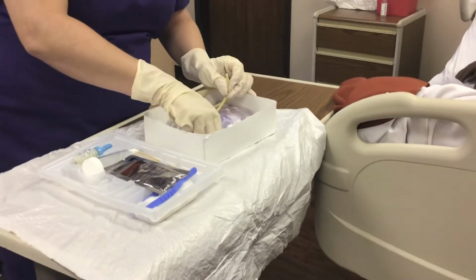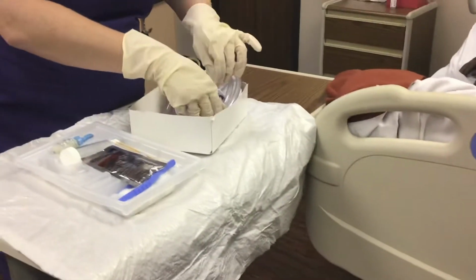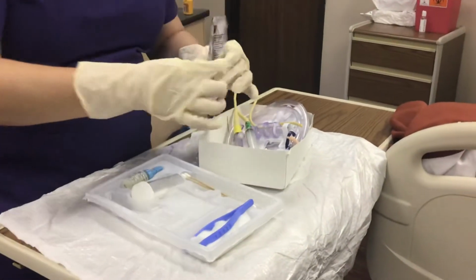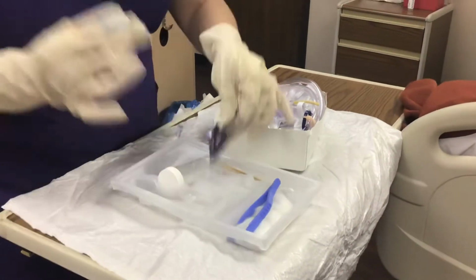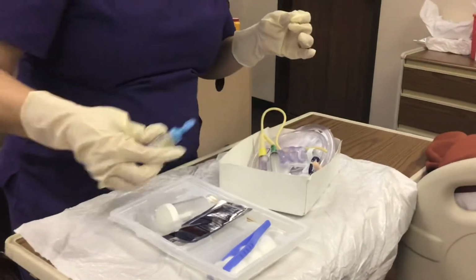Got my catheter tip here. I'm going to scoot everything over to make room for my lubricant. Okay, so here's my lubricant. Uncap it, squirt it down in there.